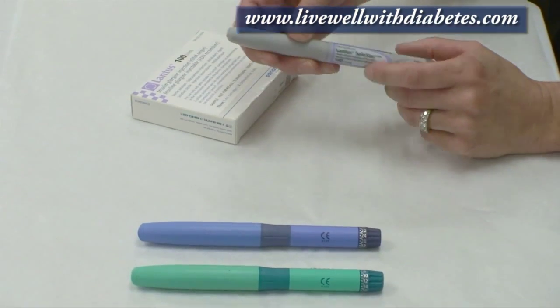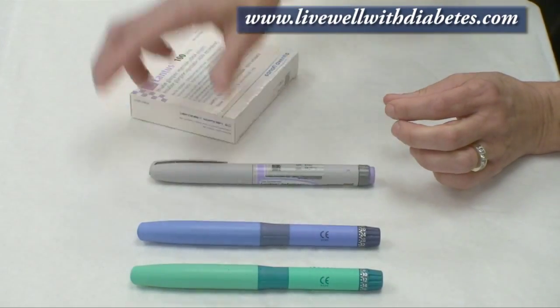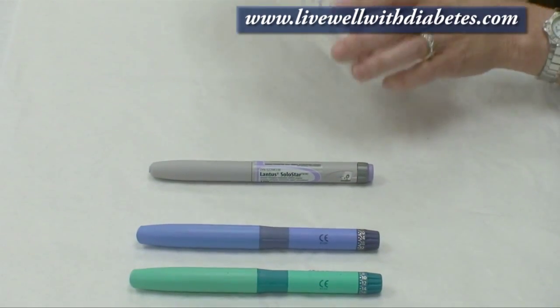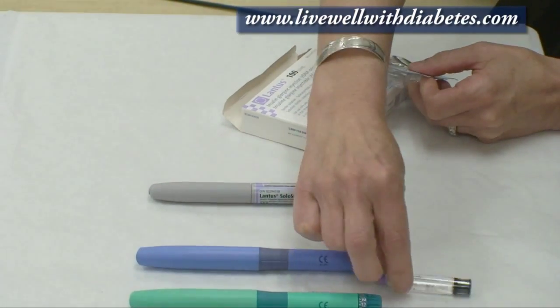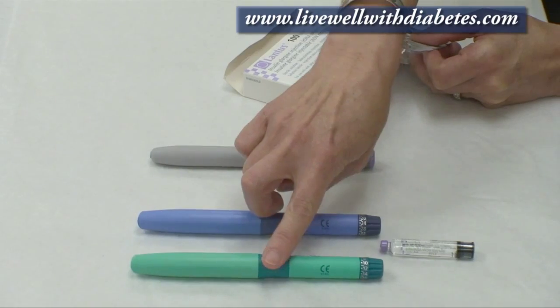I'm going to tell you about the Lantus Insulin and there are different products used for it. The Lantus can be used with the Lantus Solostar pen, which is a pre-filled insulin pen, or it can be used with a cartridge of insulin. This insulin cartridge can be used with either of two different pens.